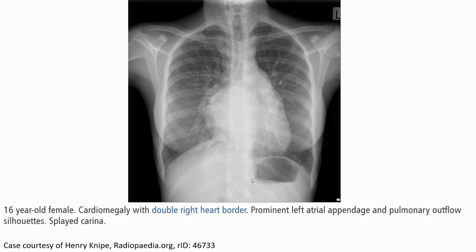This is a case of a 16-year-old female. The radiograph showed cardiomegaly with the double right cardiac border, prominent left atrial appendage, and pulmonary outflow silhouette. The images also show the same findings on the lateral view.